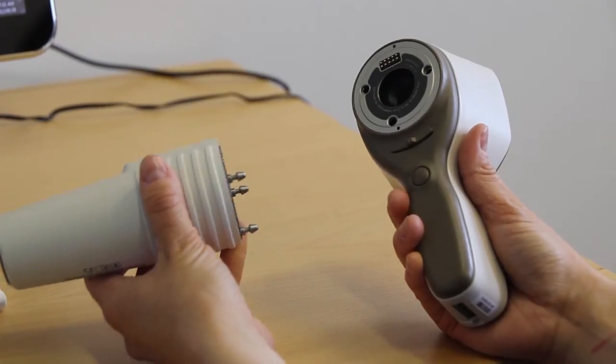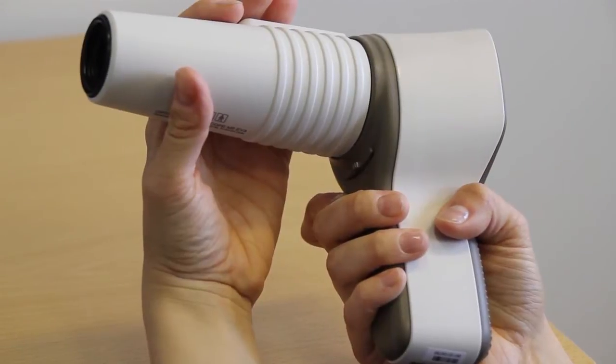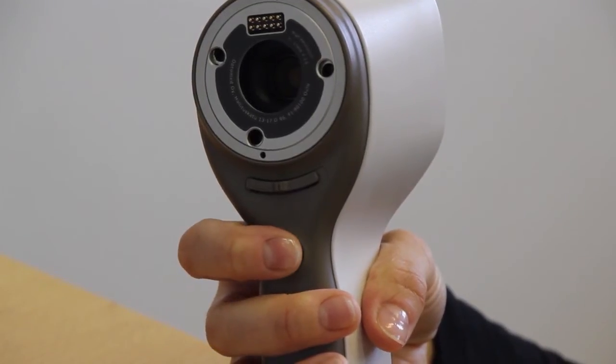The optics module is attached by pressing it firmly into place until you hear a click. To release the optics module, slide the release button. The shutter button is located under the release button.